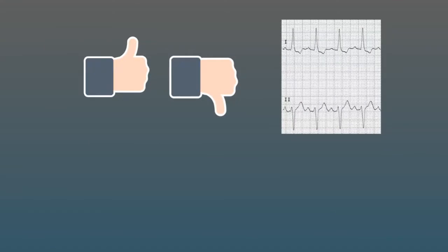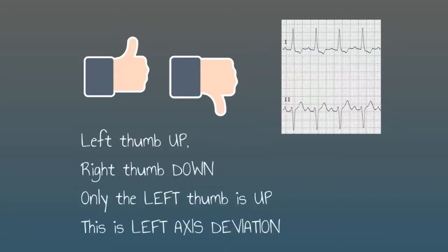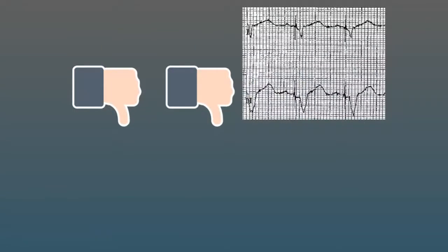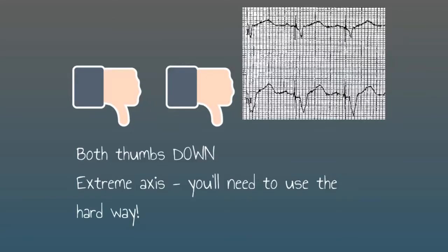In this ECG we look at lead one and see that it's predominantly upwards, so our left thumb goes up, but in lead two it's predominantly downwards so we have a thumb down. Our left thumb remains up - that means it's left axis deviation. So we've worked out how to identify both right axis deviation and left axis deviation. Sometimes you'll see that both lead one and lead two are heading predominantly downwards, with a deep S wave - in which case both thumbs will be down and you can say this is an extreme axis. In this case it's because the patient is paced - you can see pacing spikes before those QRS complexes.